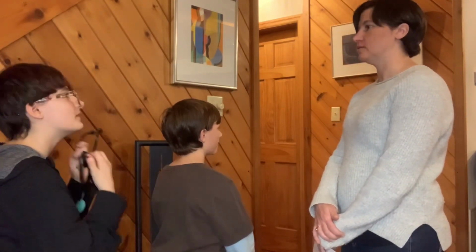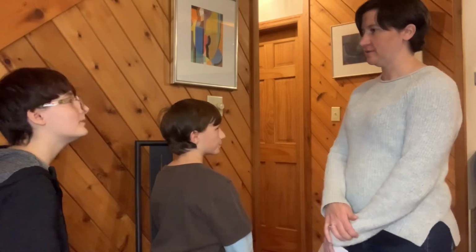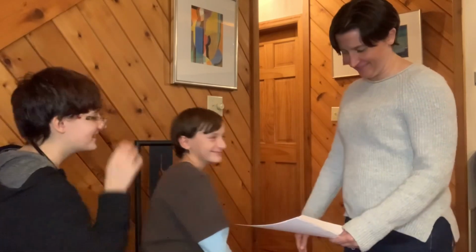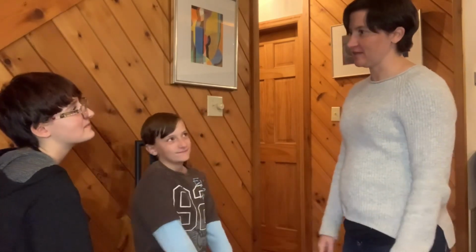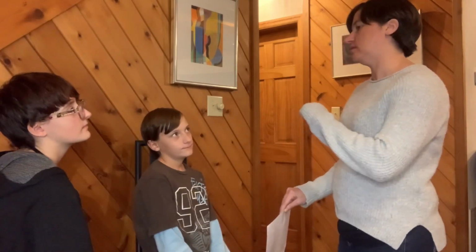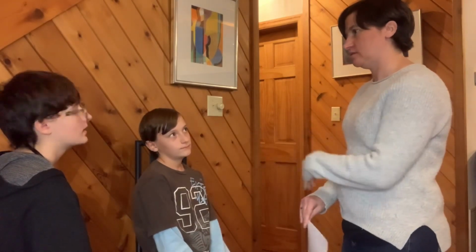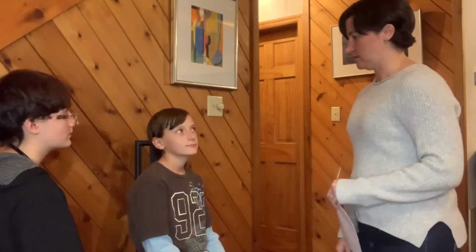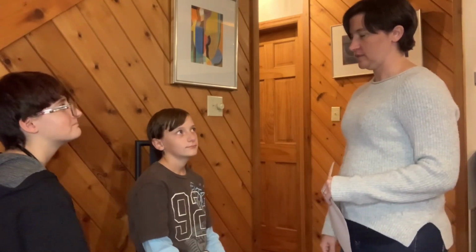Okay, great. What kind of lung sounds did you hear? All normal. All normal lung sounds, great. Good job. So thank you, Mars. You did a great job. Do you have any questions, first of all? Don't think so, no. Okay. Do you understand why we had him sit forward and separate the shoulder blades? So you can see where to correctly put the stethoscope.